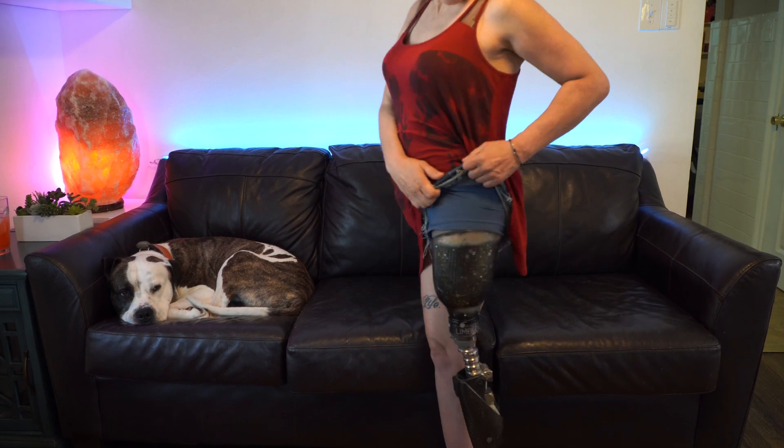Hey internet friends! This is Christina, the Amputee OT, and I wanted to show you that I got a definitive prosthetic socket.